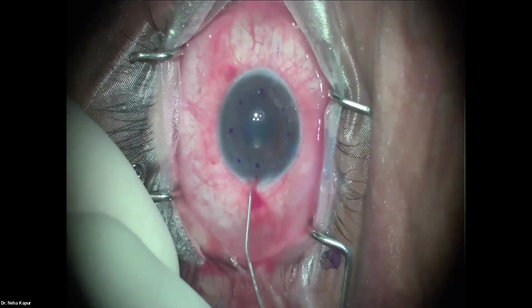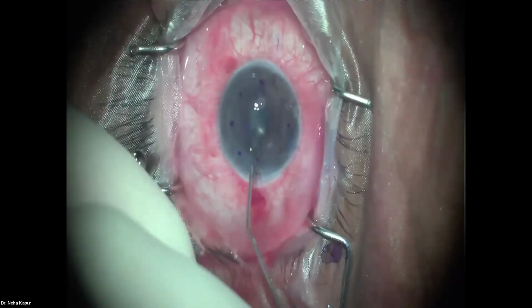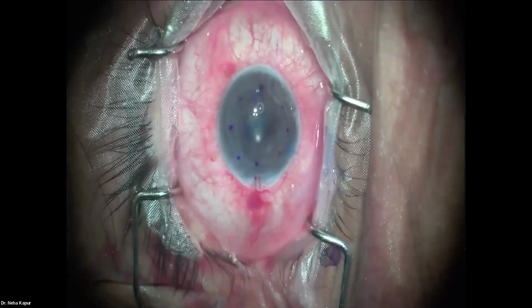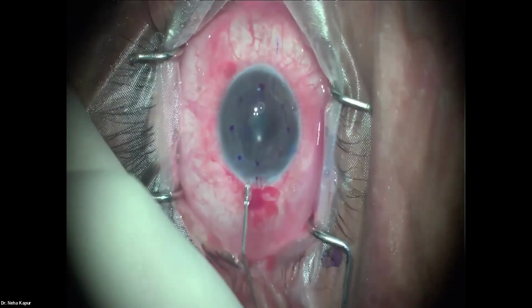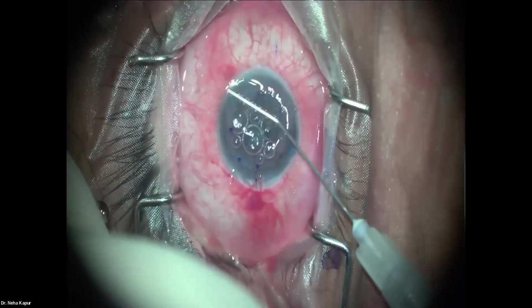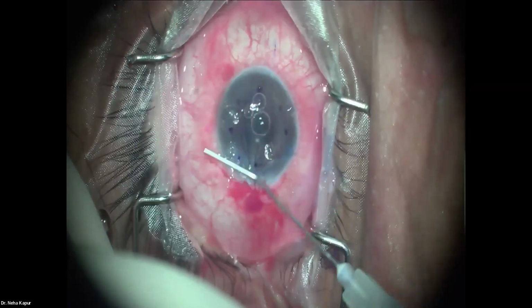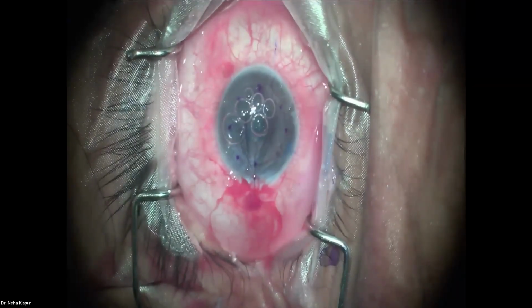The next step is you put an air bubble inside the eye. But the air bubble, the plane is important. And the air bubble has to be put under the lenticule. Hydro.